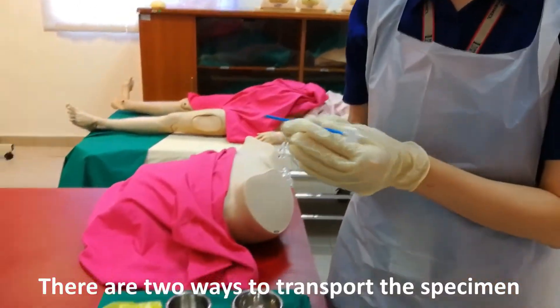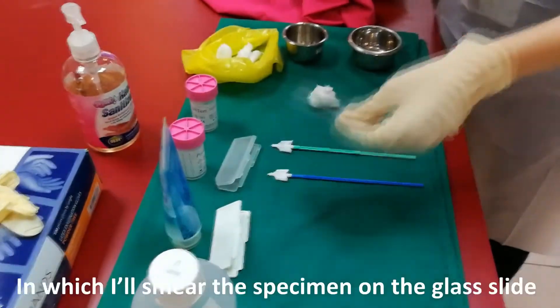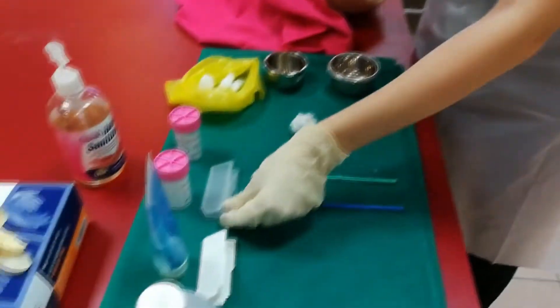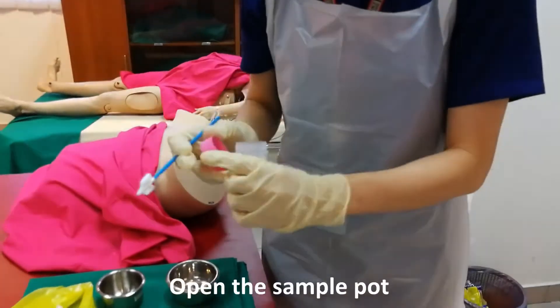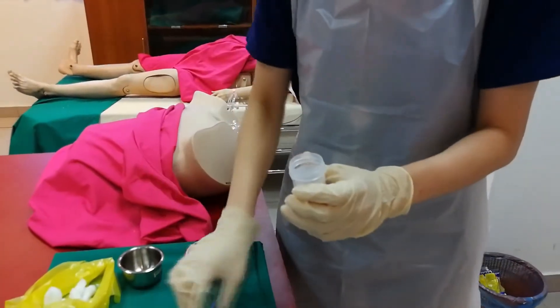There are two ways to transport the specimen: either through the conventional method, where I'll smear the specimen on the glass slide and fix it with alcohol, or the second method, which is the liquid-based method — open the sample pot, place the sample, and close.